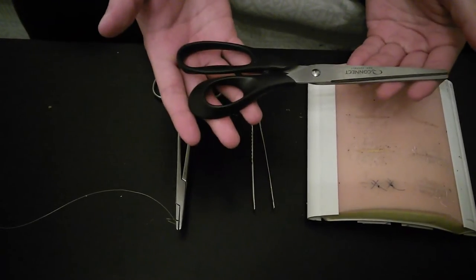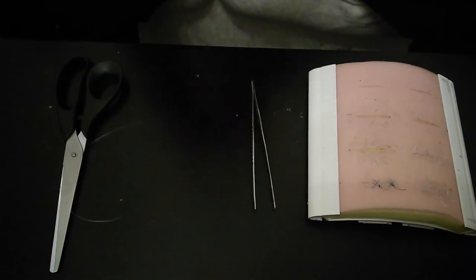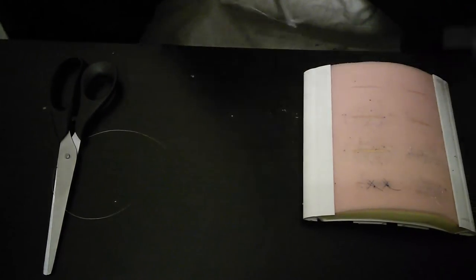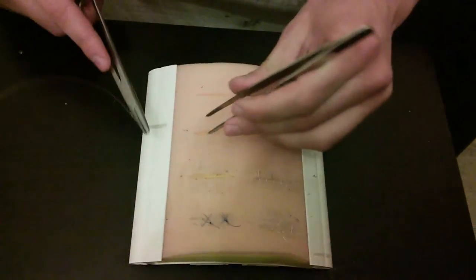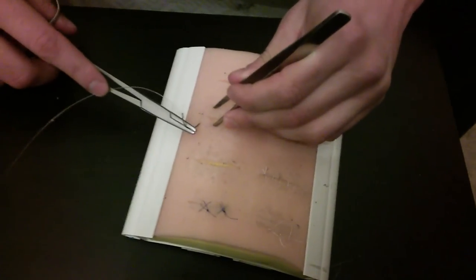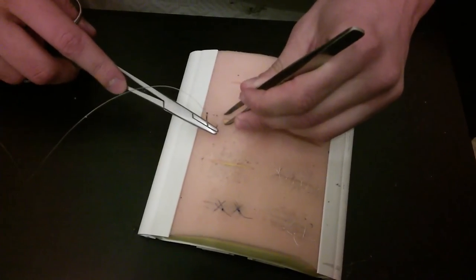Unfortunately we don't have the correct kind of scissors available today. So we are going to do a continuous one for the sake of this tutorial. We are going to start about 5mm away from the wound.